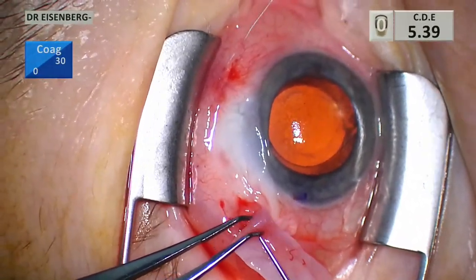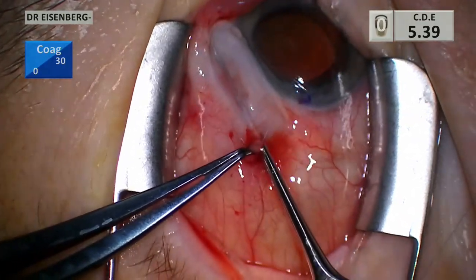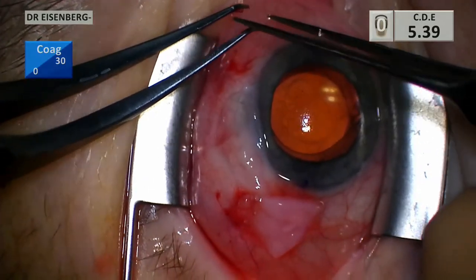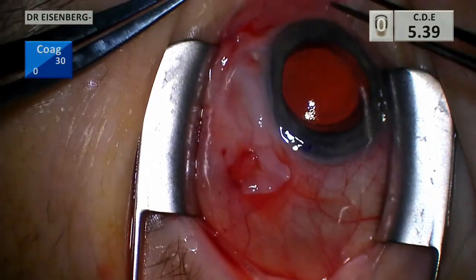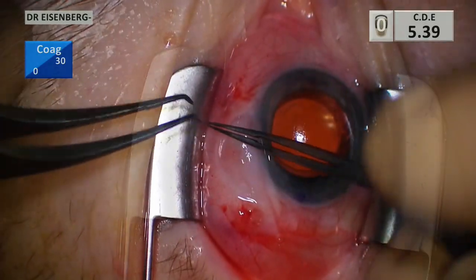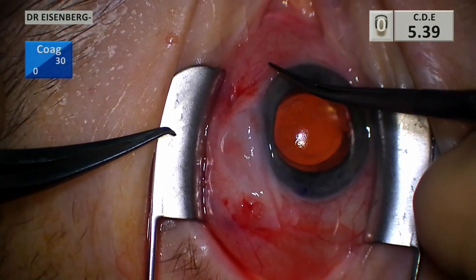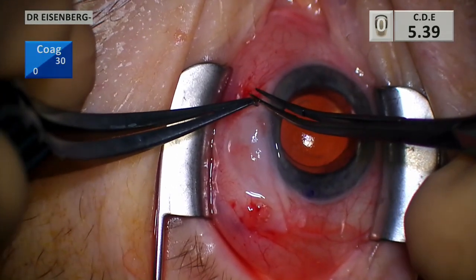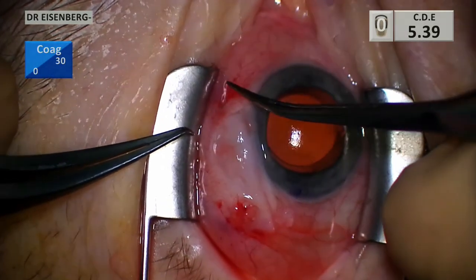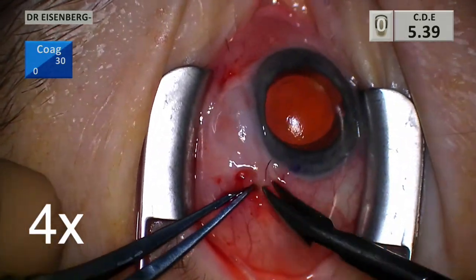Back to the first case — here's our graft that's been trimmed with the sutures placed. It's basically a horizontal mattress-type suture: I grab both sutures and pull, which helps pull the graft all the way across and snug it in. Now I know my graft is nice and secure in a great position. This is just a small suture to keep the graft from going anywhere while I'm closing the radial incision — probably not even needed once everything's closed, but it's nice to prevent it rolling up on itself.